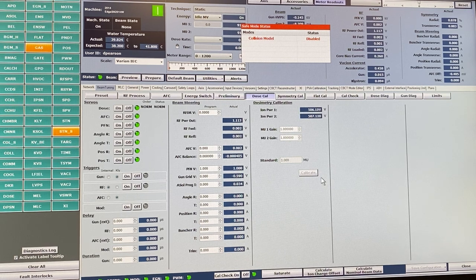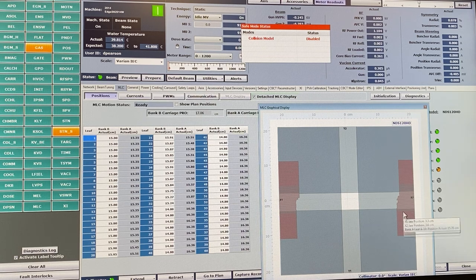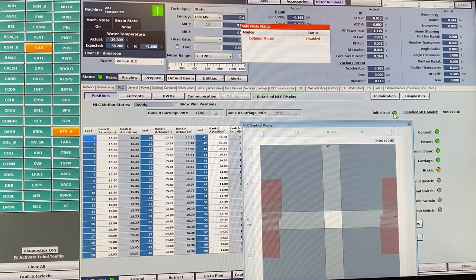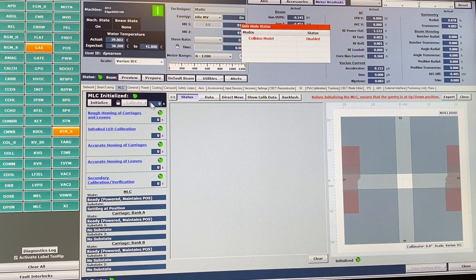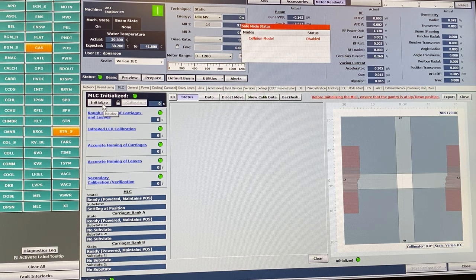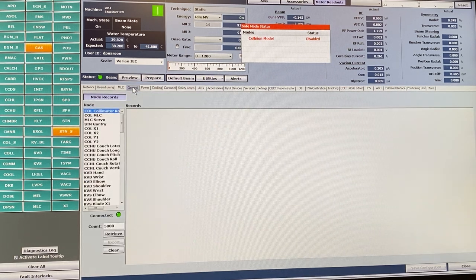Under beam tuning, the MLCs tab is where we often come to reinitialize the MLCs. You can see the current position of the MLCs and whether they're initialized — if the initialize indicator is not green, you need to reinitialize them. To do that, hit the initialize button and confirm. The whole process takes a couple of minutes as it moves every MLC. If this is not green, you want to initialize the MLCs from here.